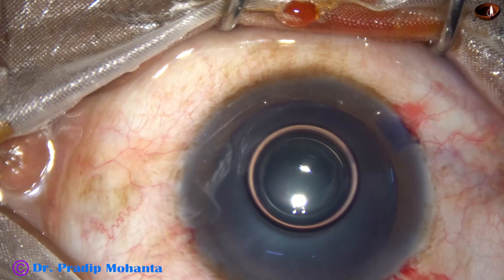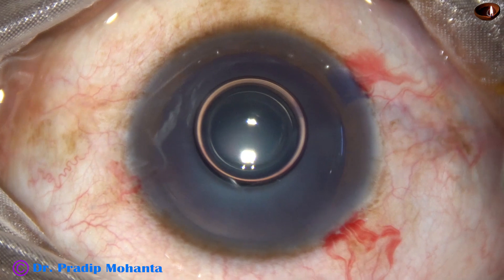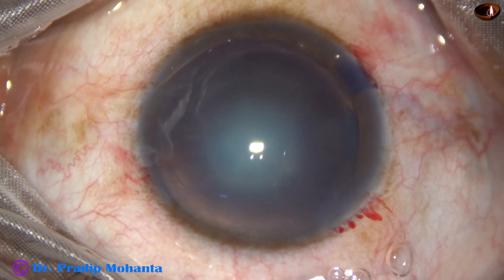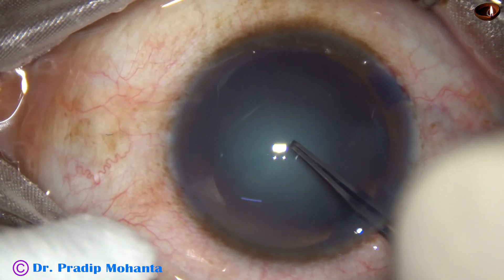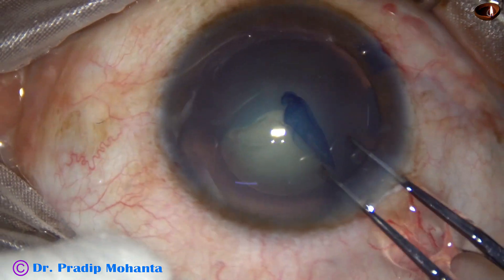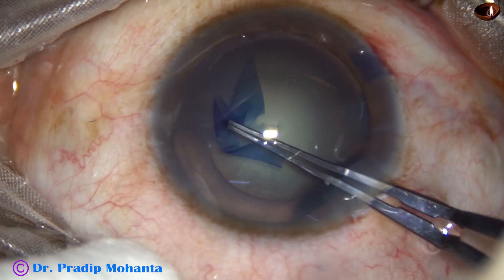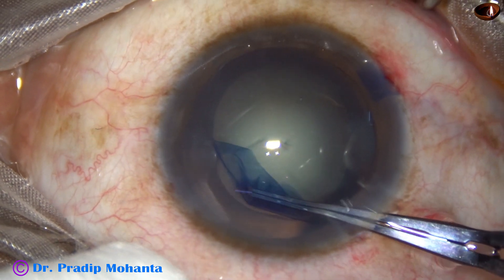Capsulorhexis becomes easy, and we can see clearly when we stain the capsule with trypan blue dye, particularly in cases where there is low contrast. Capsulorhexis is performed with the help of Utrata forceps. The anterior capsule is scratched, a capsular tag is raised, and this tag is guided anticlockwise all around. An optimum size rhexis of about 5.5 mm is achieved.